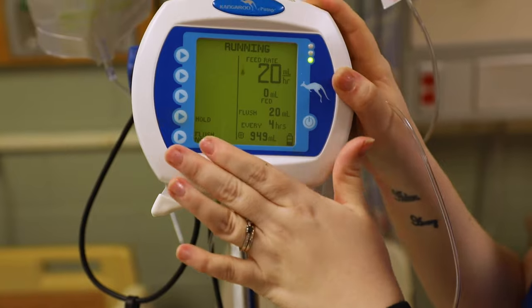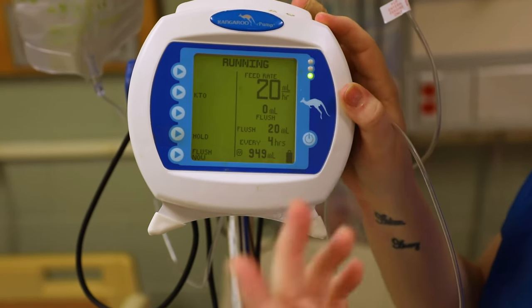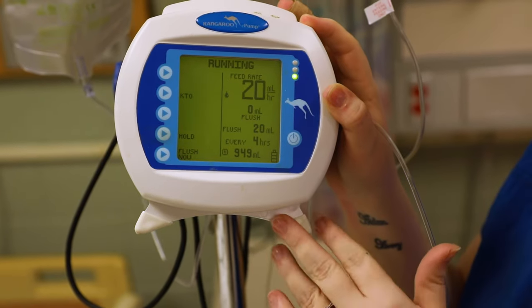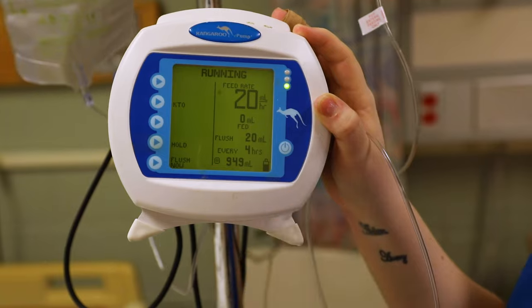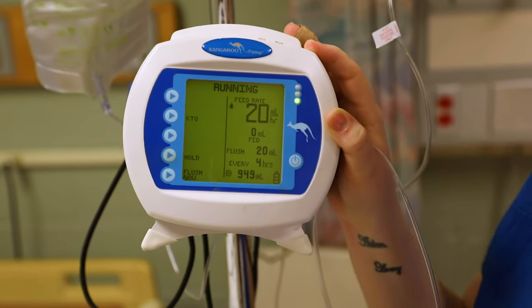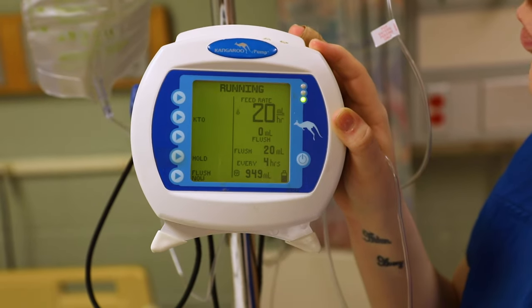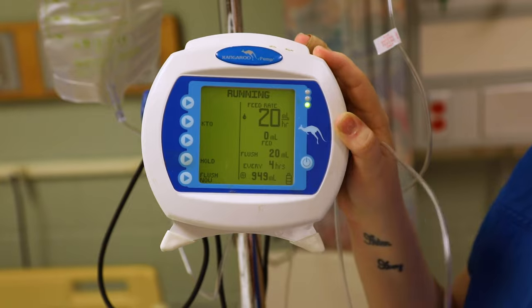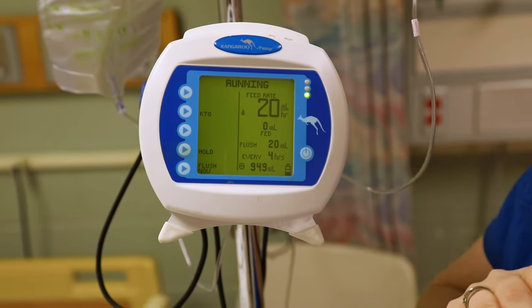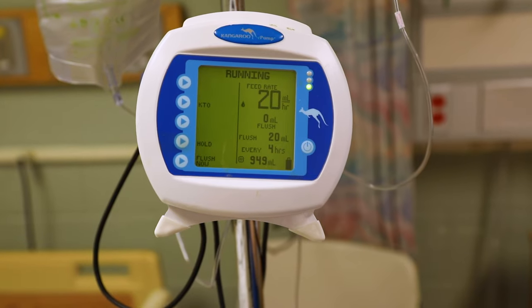One more important note: if you're going to lay your patient flat for any patient care — such as cleaning up the patient — the feed does need to be on hold. You need to make sure the patient is positioned at a specific degree level based on your policy. Usually it's a minimum of 30 to 45 degrees that the patient needs to be sitting up. Be sure to follow your organization's policy, directions, and rules.